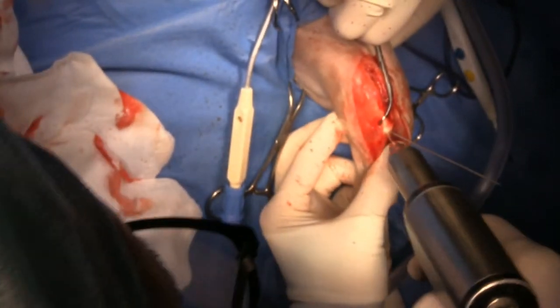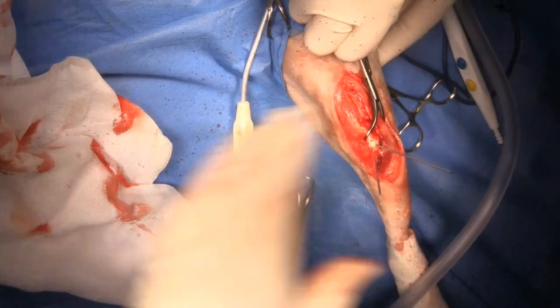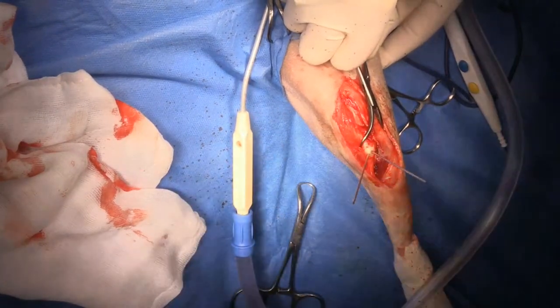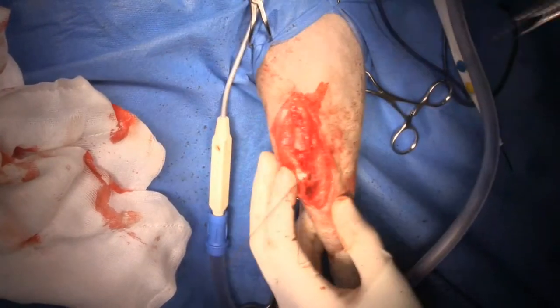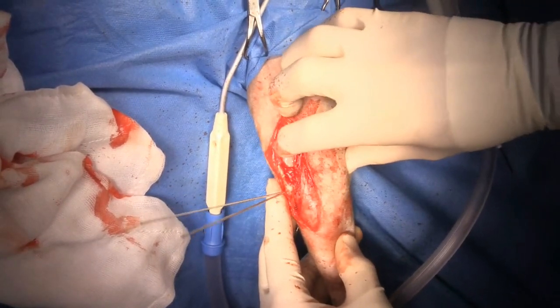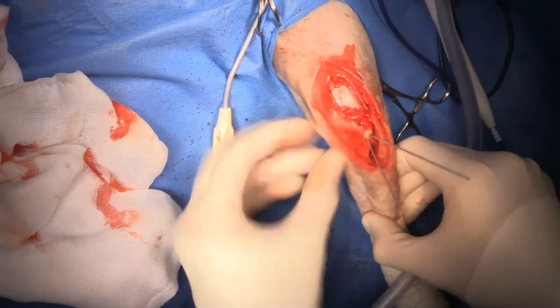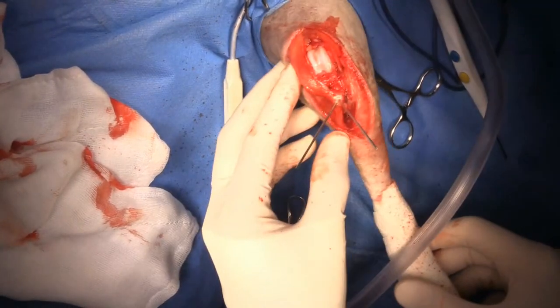I'm palpating caudally to make sure I can feel that back there, and comparing pin length. Now we'll remove our towel clamp and make sure I've moved it over as far as I thought. I can luxate it but it really wants to stay in - and that's even without any kind of soft tissue repair. Now this is aligned really nicely with my trochlear groove.